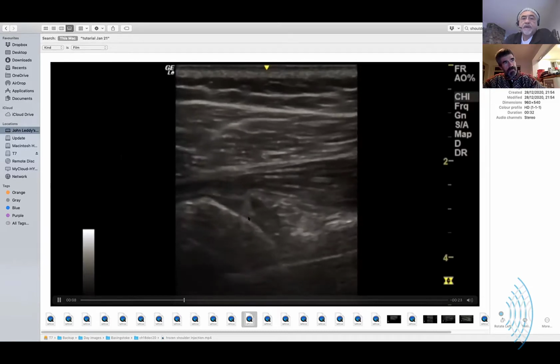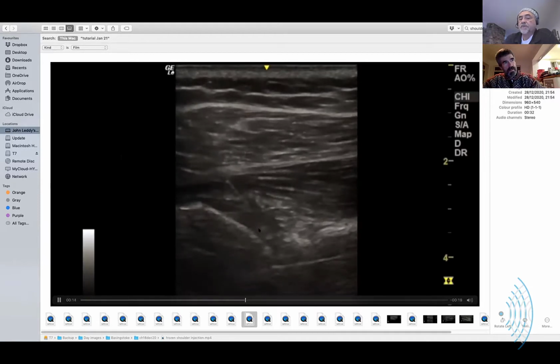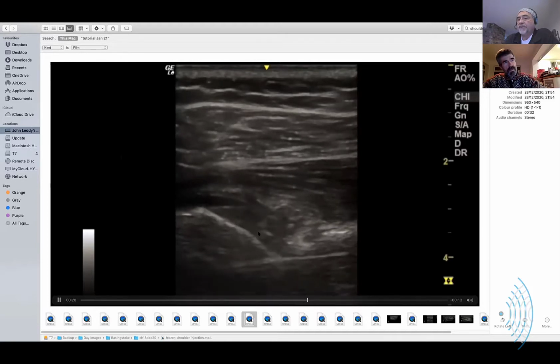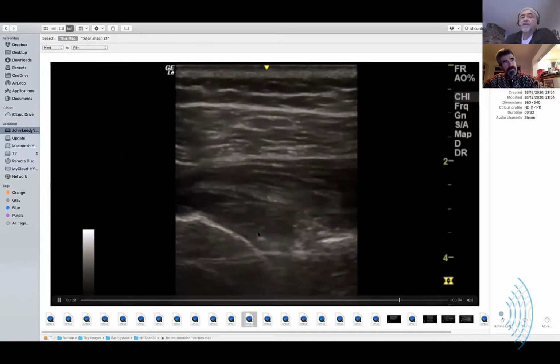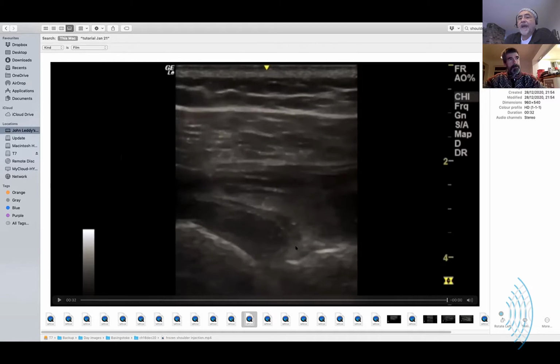Yeah, absolutely. I've just been with some guys sometimes in their labs that are supposed to be really quite adept at doing this, and I've watched them be quite challenged with identifying the plane of the needle. And I know that if you're doing this by yourself in the room with the patient, there's the nuances of soft tissue movement. There's just in and out of echoes. You just don't commonly see this perfect white line that goes from the outside all the way down to where it's delivering its goods. Yeah, and sometimes that's slightly imperfect technique.